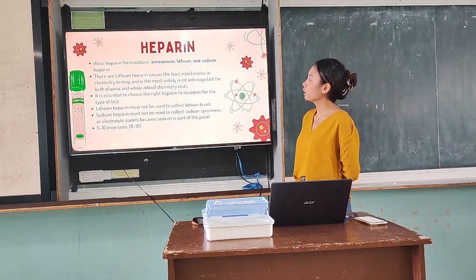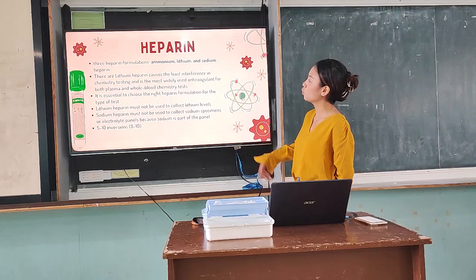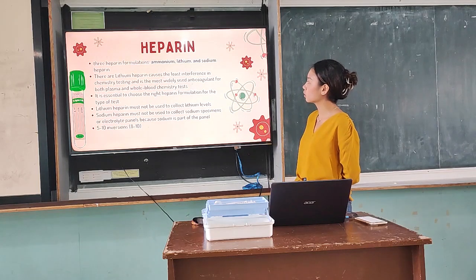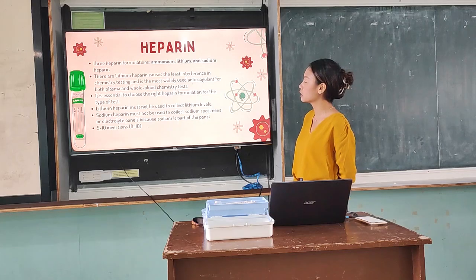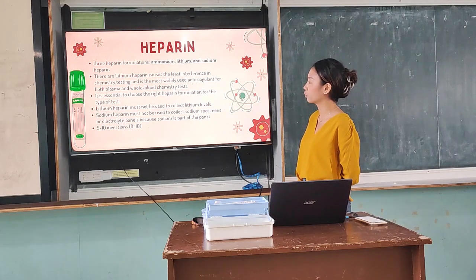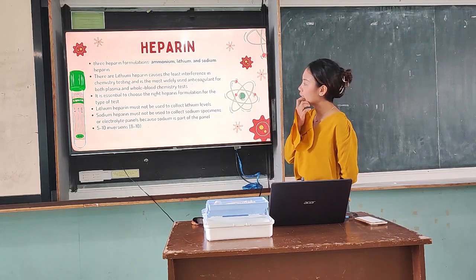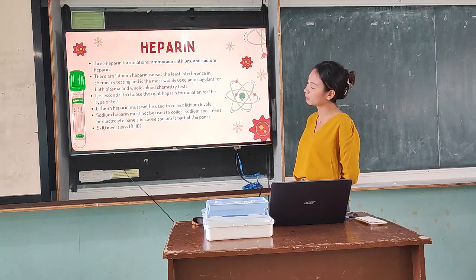Three heparin formulations, we have ammonium, lithium, and sodium heparin. The lithium heparin causes the least interference in chemistry testing and is the most widely used anticoagulant for both plasma and whole blood chemistry tests. It is essential to choose the right heparin formulation for the type of test.